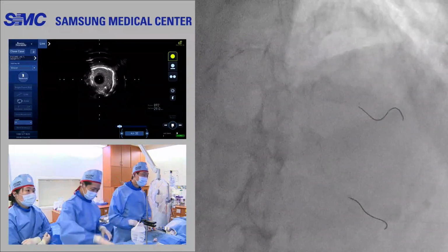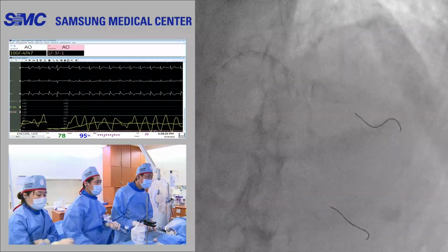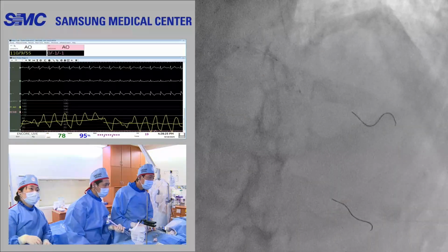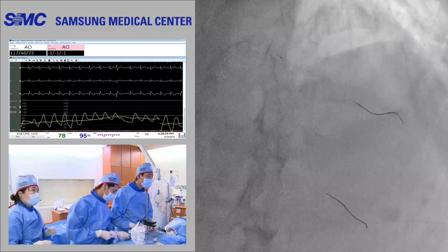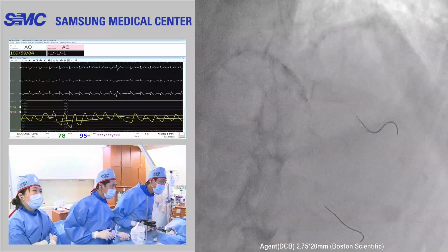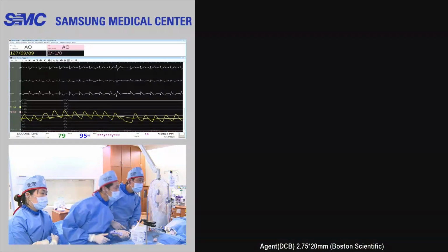Maybe the dissection in here, in the south, this is 3 o'clock, and goes to the opposite way, far away. This is not a calcified tube. Of course, there is calcium plaque, but there's also normal plaque tissue area. That's, I think, not a perfect effect, but not no effect.